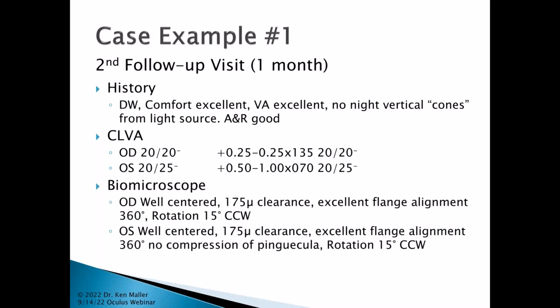So well centered. About 175 microns of clearance in both. The flange was aligned in both. The rotation was right back to where it had been right at the beginning, and now we had no compression of the pinguecula. So very efficiently got to our final pair of lenses, and of course she did very, very well with this. Recheck her 5 months later, and I've seen her now since then over a year, and she's doing fantastic. So everything has really been very nicely addressed, and she's very stable.